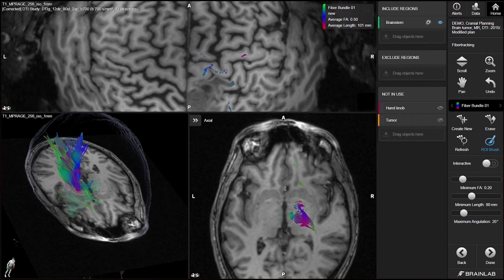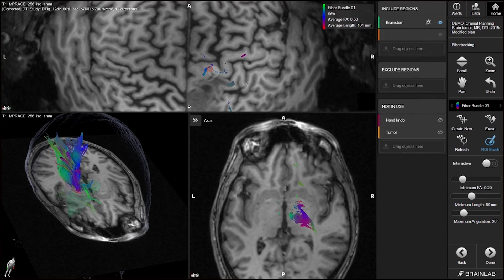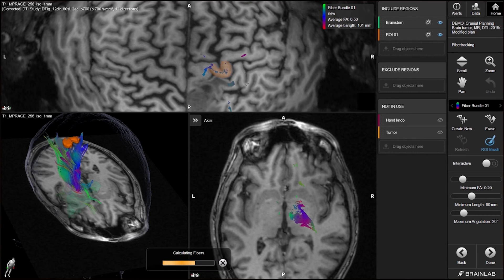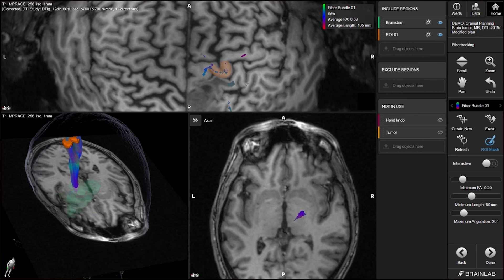The all-new Brain Projection View enables direct review and functional planning on the cortical surface. With functional areas identified, a brush can be applied to mark the area as a region of interest.